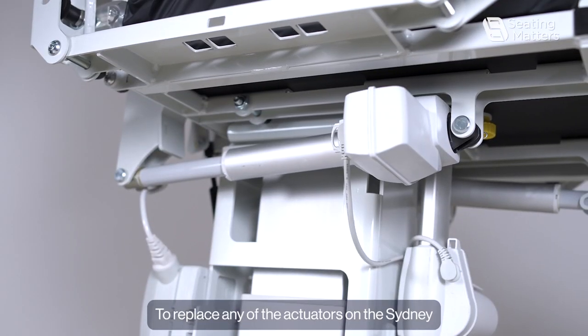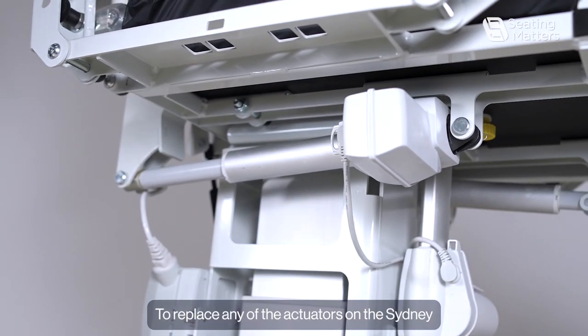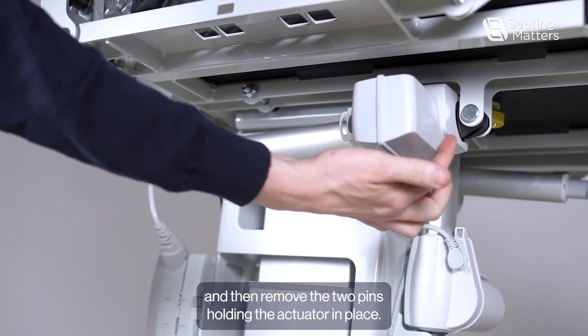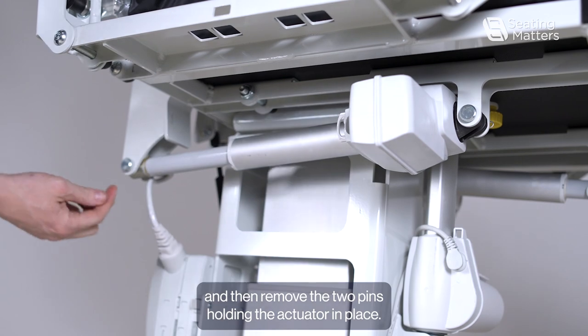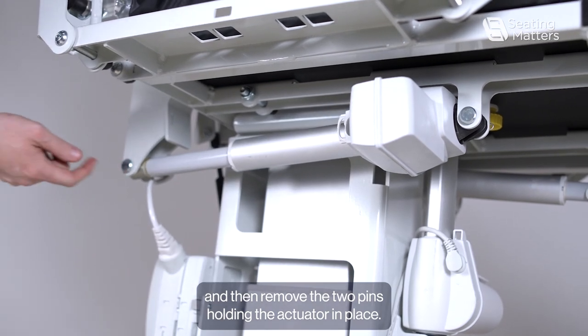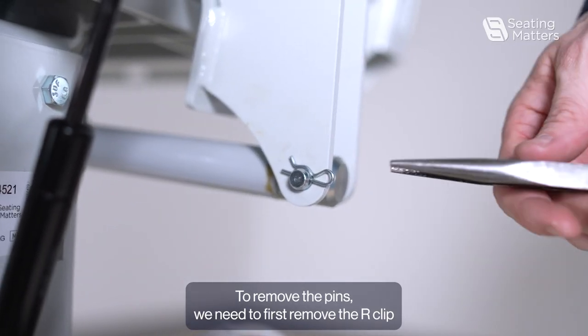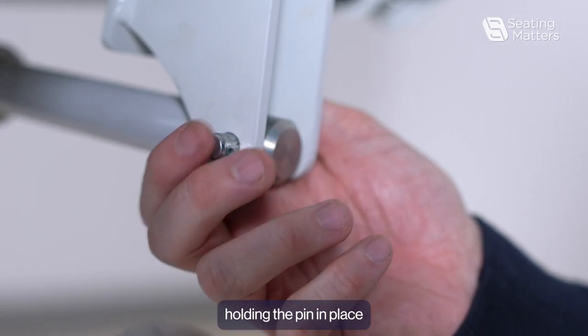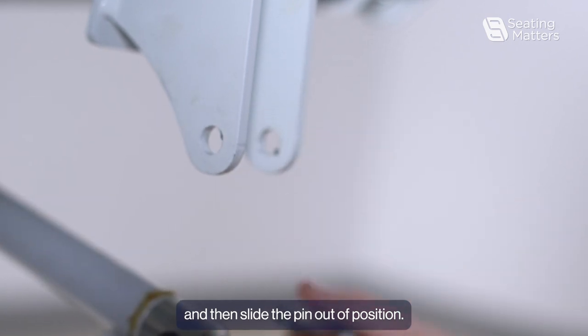To replace any of the actuators on the Sydney, we first need to unplug the actuator that we're replacing and then remove the two pins holding the actuator in place. To remove the pins we need to first remove the R clip holding the pin in place, and then slide the pin out of position.